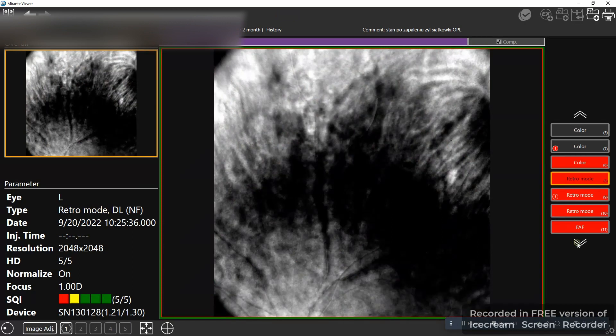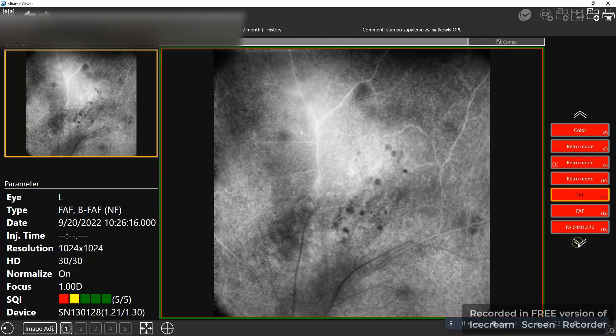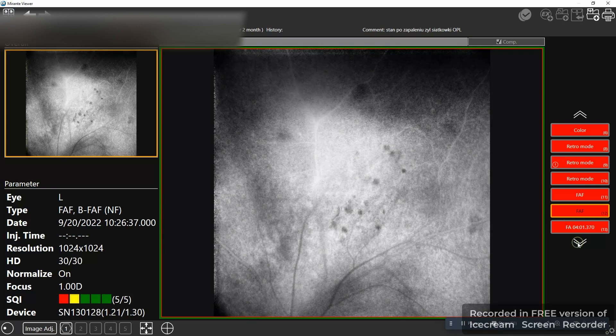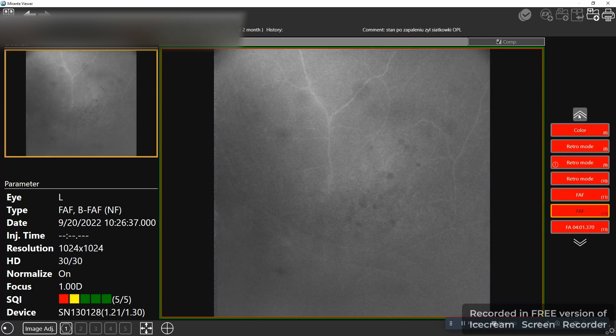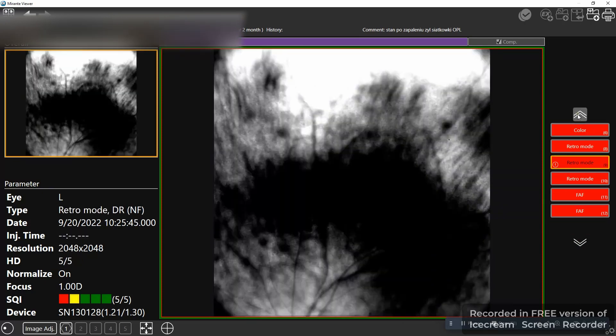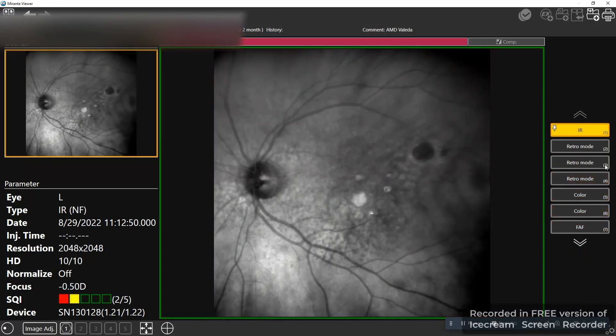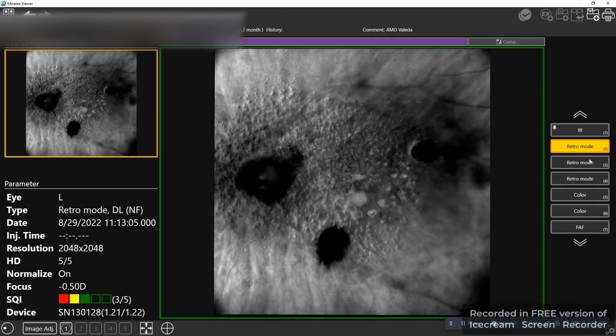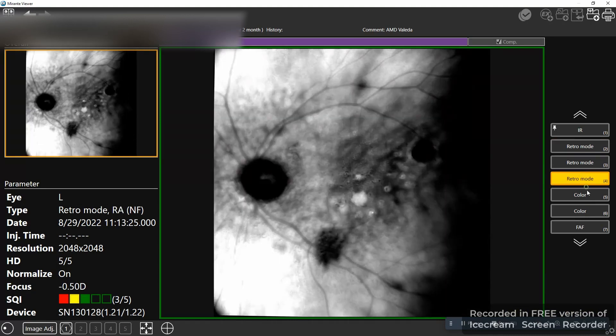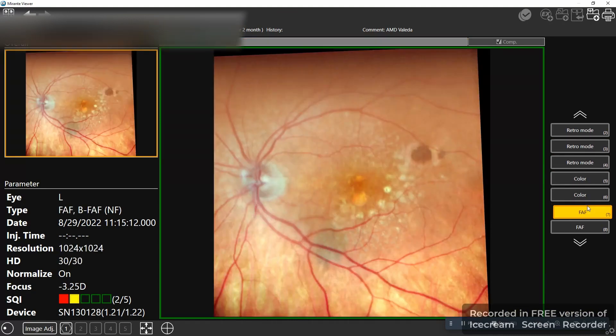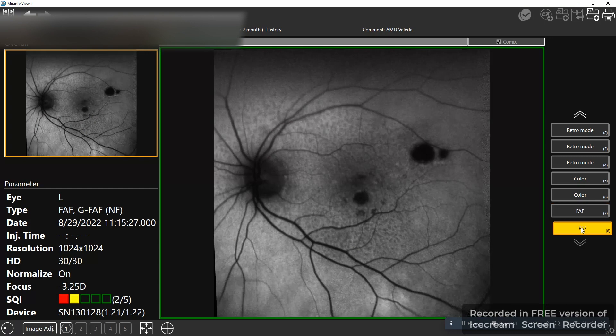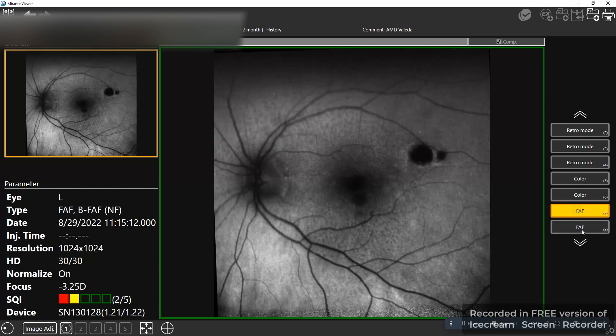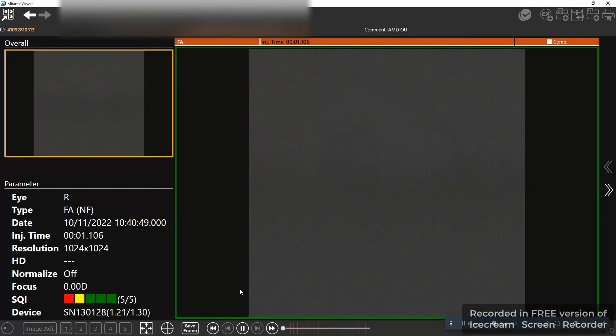This is basically a viewing option in which you fly through different modalities of the same spot on the retina. This is much easier to comprehend for your brain than having the fluorescein angiography on the left side and let's say color fundus on the right side. Here you just see the same spot in different modalities and different types of autofluorescence.